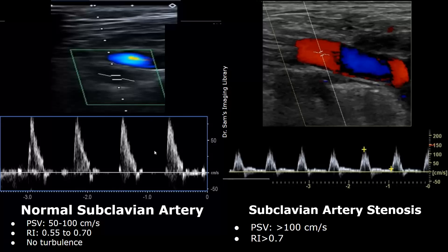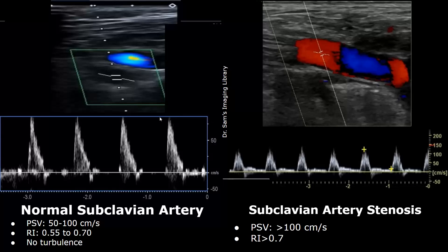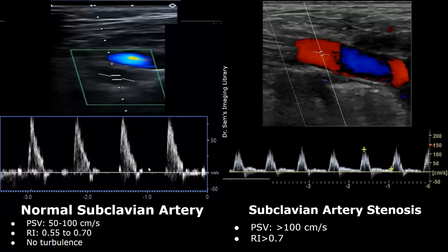On the left we have a normal subclavian artery. This is a normal spectral Doppler waveform of the subclavian artery. The peak systolic velocities can be between 50 to 100 centimeters per second. The waveform has sharp peaks and zero to very slow diastolic flow. The resistive index is between 0.55 to 0.7. No turbulence will be seen in a normal subclavian artery.